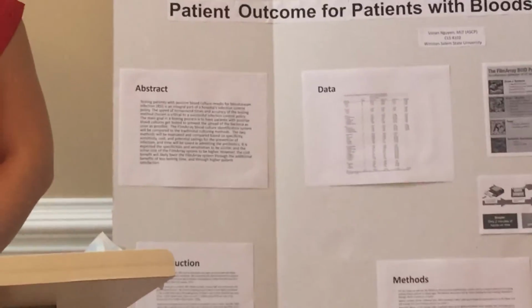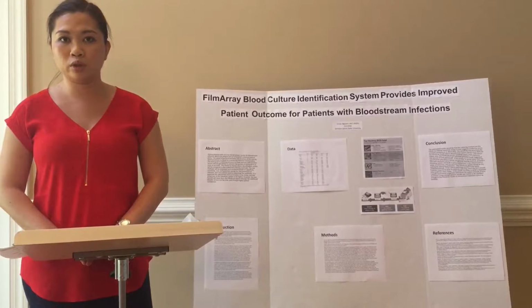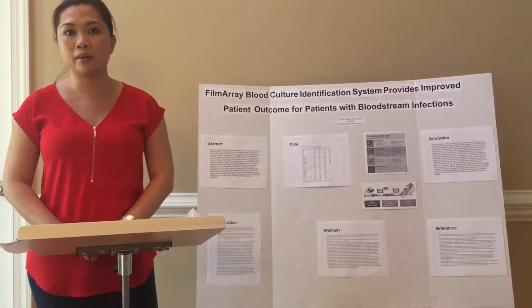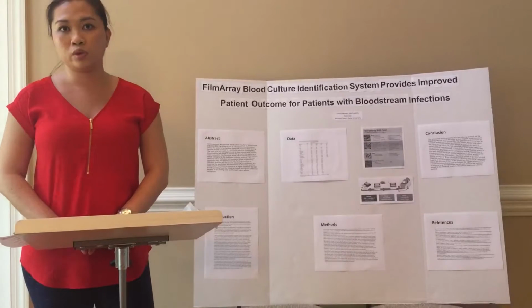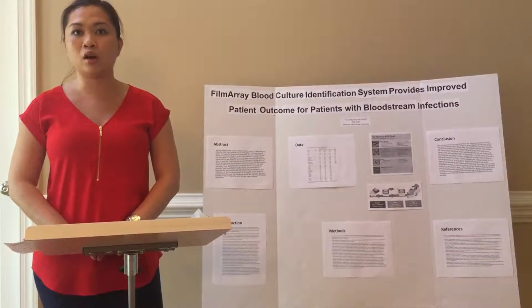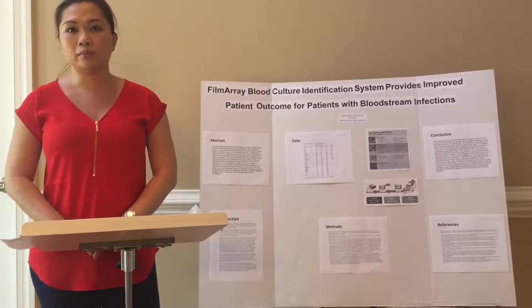So as a lab technician, we all know how important it is when you have a positive blood culture. You need to work fast, have a fast turnaround time, and an accurate result so the doctor can administer antibiotics for the patient on time without delay of the outcome.